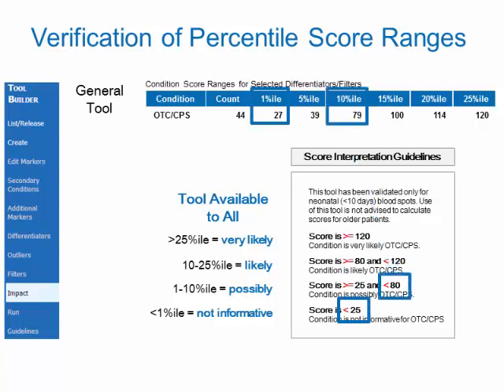A score between the 1st and the 10th percentile is informative, but is labeled as possibly. Any score greater than the 10th percentile, in this case a value of 80, is increasingly more and more likely to reflect a true positive case. As stated before in this series, scores that exceed the bottom quartile, in other words, greater than the 25th percentile of all scores calculated for true positive cases, become increasingly self-evident and should never constitute a diagnostic challenge.